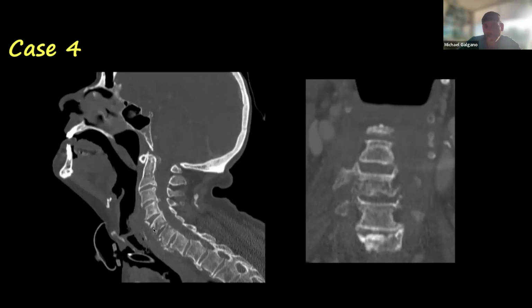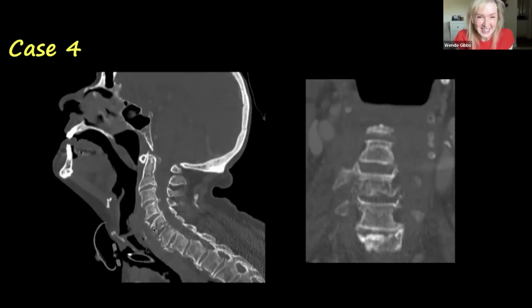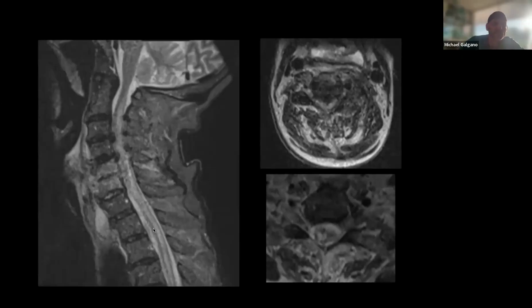At this point, I had never been consulted on the patient. So the medicine team was just, your arrow, is that a fracture? Or is that just dehiscence or ALL destruction there? It looks like he's a little bit too kyphotic at that level of your arrows, right? Right, and his head is definitely.